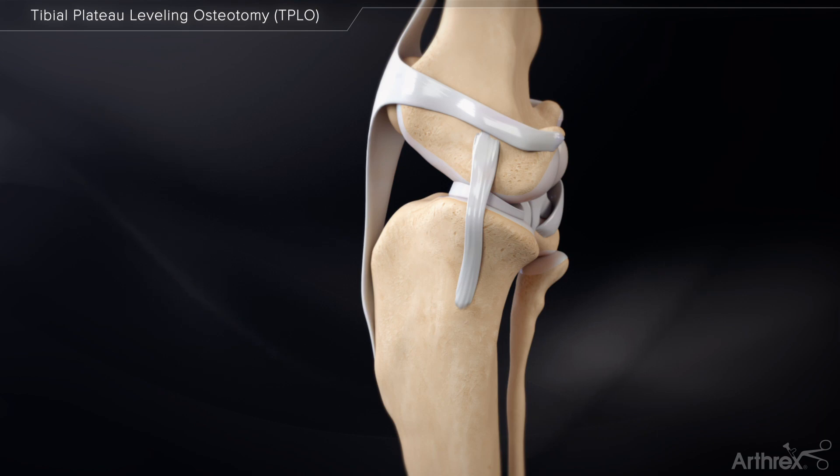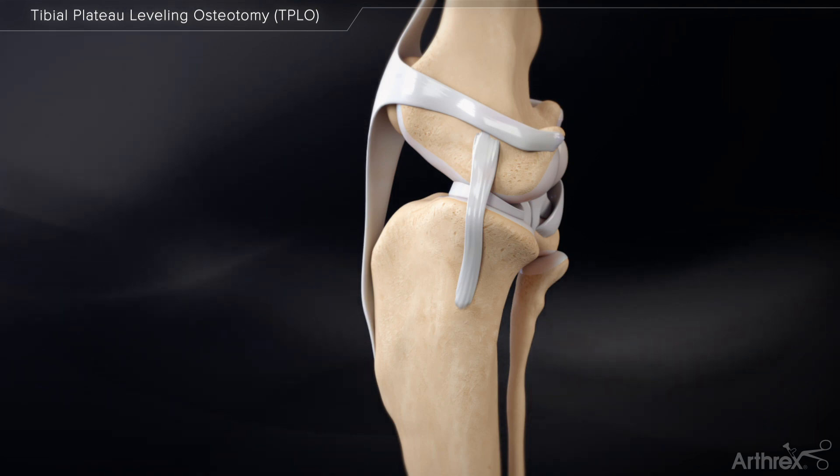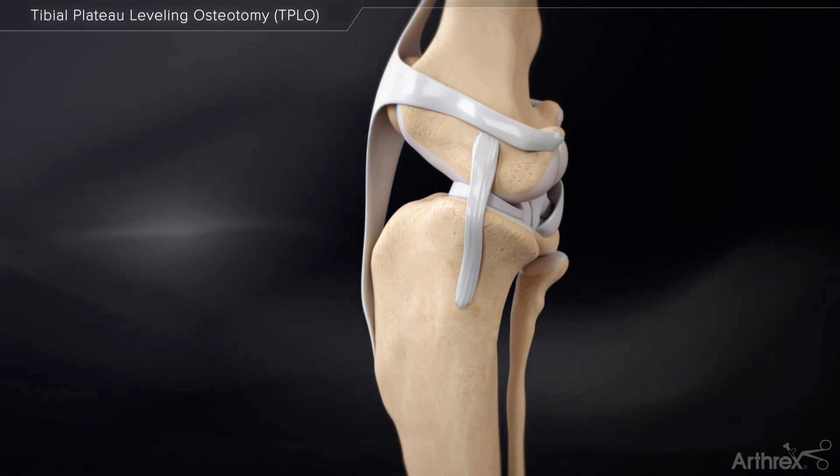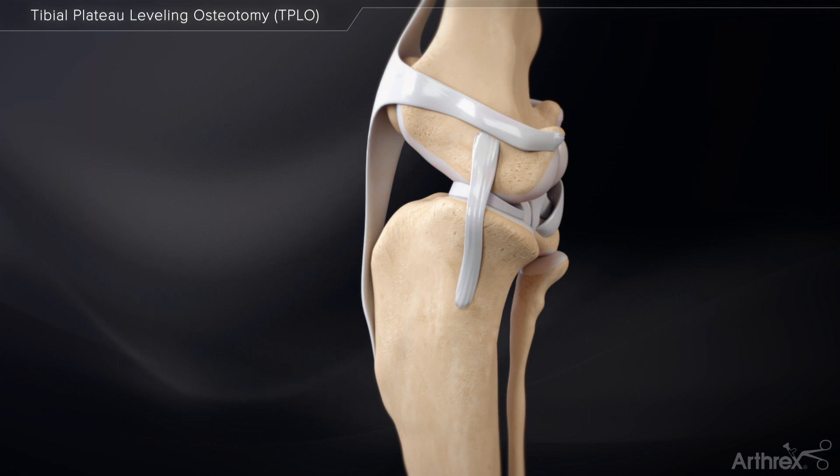To perform a TPLO, first find the tibial plateau angle to determine the degree of rotation and the appropriate size saw blade to perform the osteotomy. A tibial plateau leveling osteotomy, or TPLO, can be performed with or without a standard jig, but an appropriate size saw blade is required.